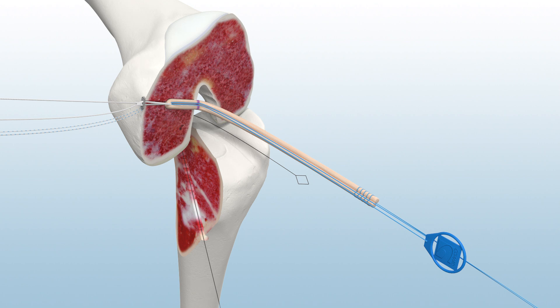If graft placement optimization is needed, use the Infinity Reversible Button tab to adjust the position of the graft within the tunnel. For tibial graft passage, load the tails of the graft and retrieve through the tibial tunnel.